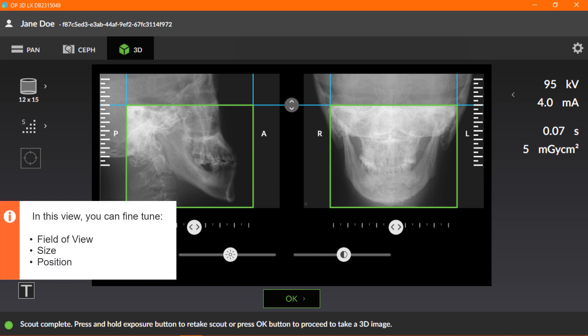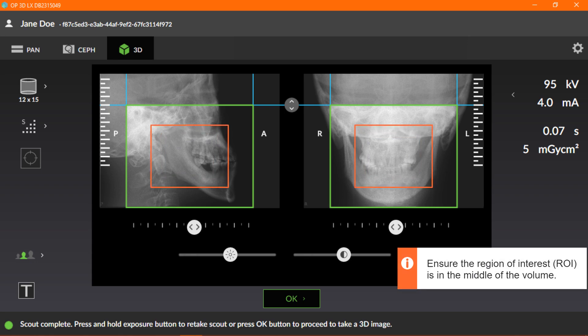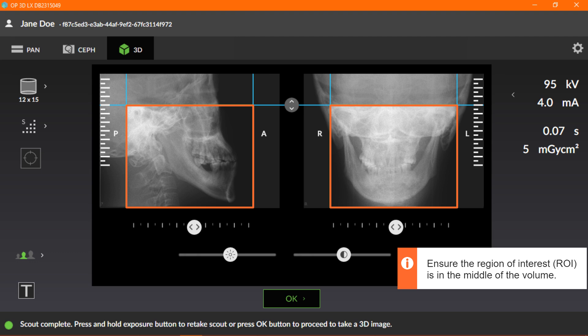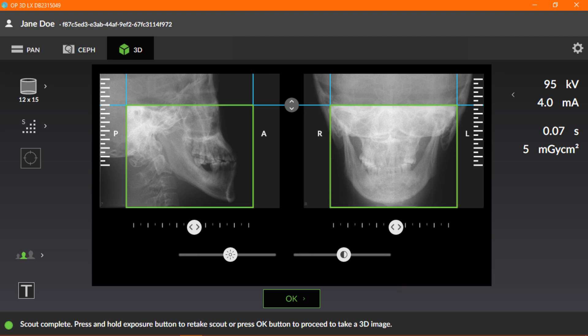The smart view 2.0 scout image is shown on the GUI after the scout image has been taken. In this view, you can fine-tune the field of view size and position for the actual 3D image. Ensure the region of interest, ROI, is in the middle of the volume.